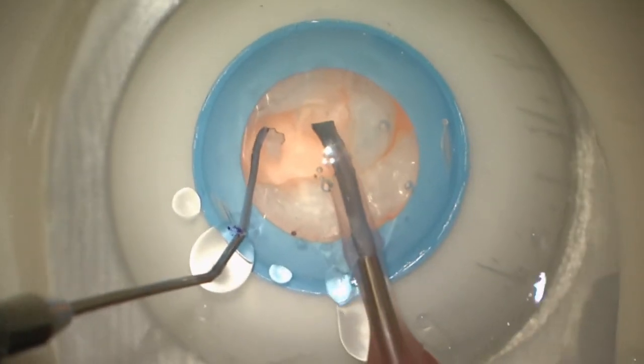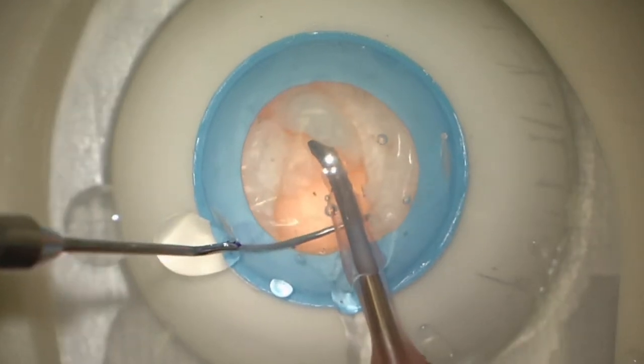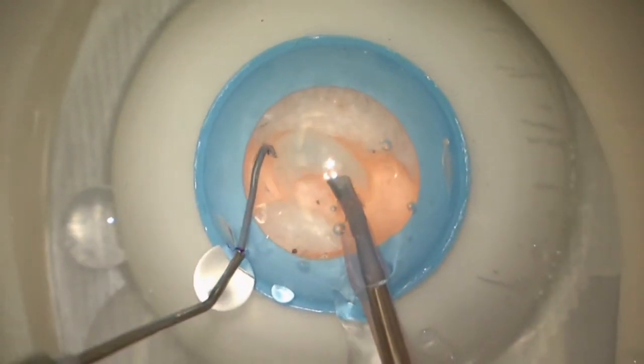One disadvantage of this material that simulates the nucleus is that it begins to dissolve with time, so you have to work quickly, otherwise this material dissolves on its own.